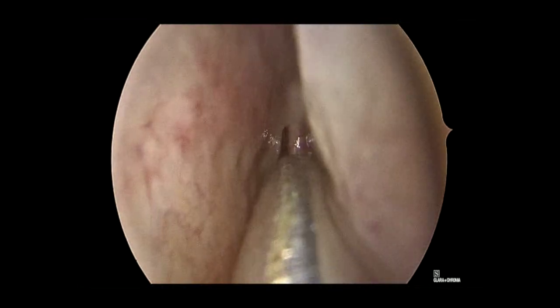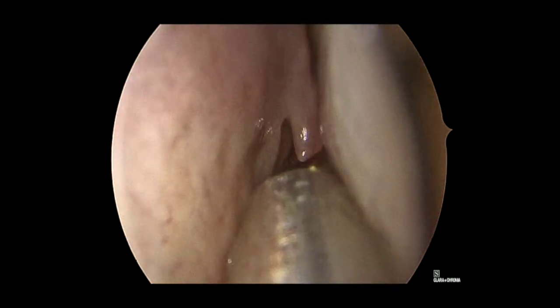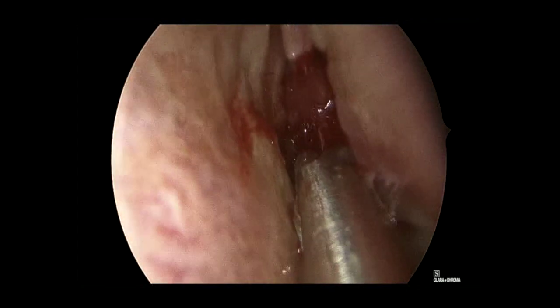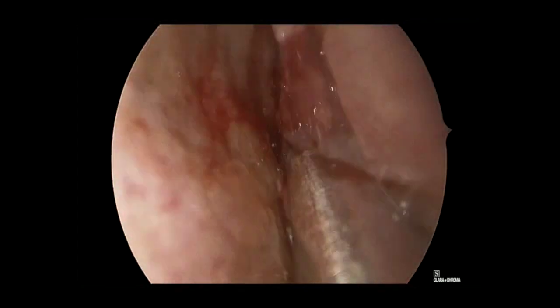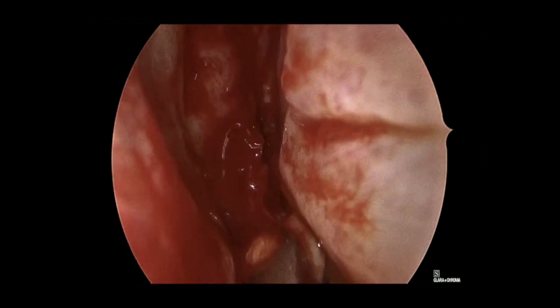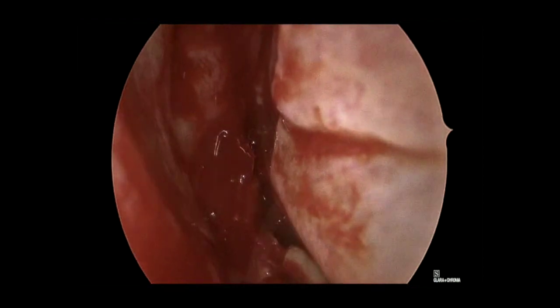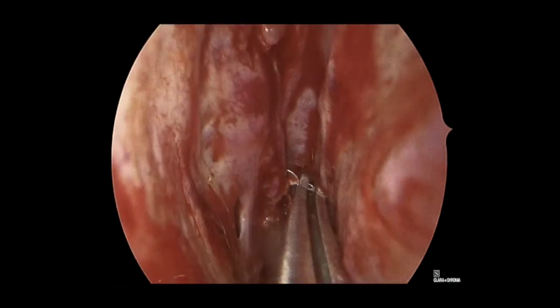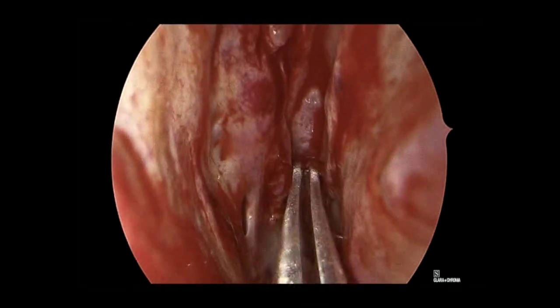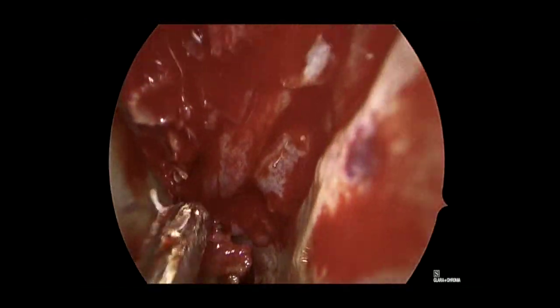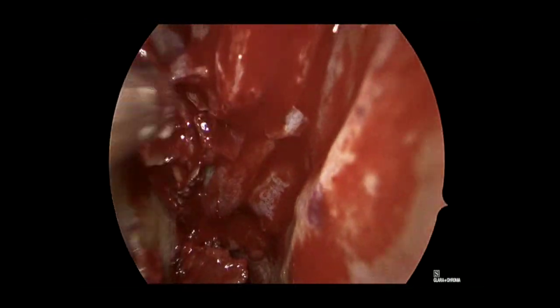We're in the right nasal cavity now, resecting the right middle turbinate, as you can see here. This will gain us some access to the back of the nose, as well as allow us to examine the tumor on the right side. We are cauterizing the stump of the middle turbinate with a bipolar cautery. I prefer bipolar cautery in this case to not spray any cautery onto the SPA or posterior septal branch for a potential flap.